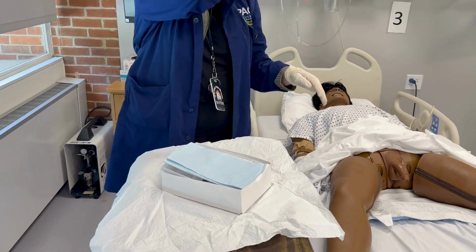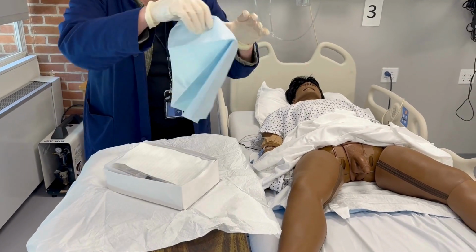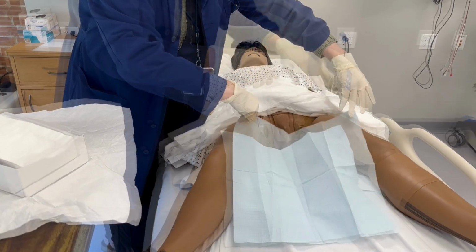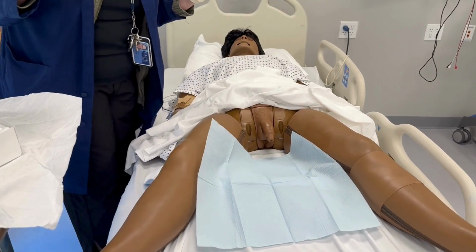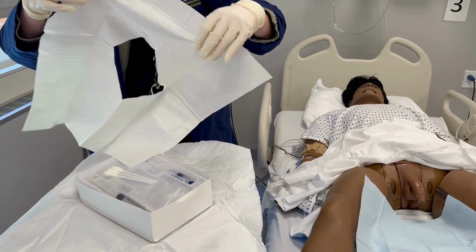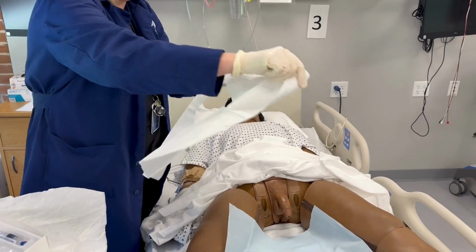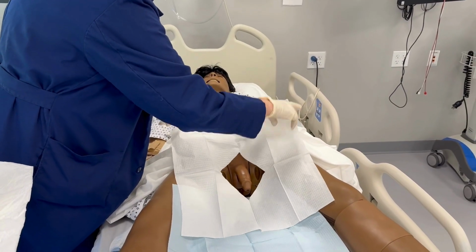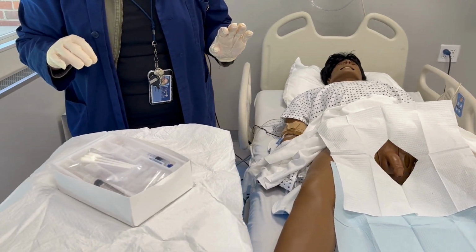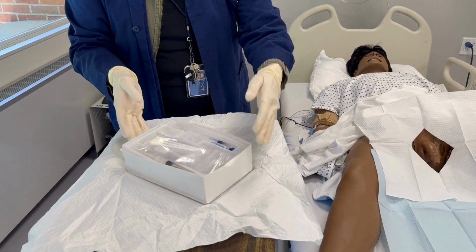Place sterile drape between the patient's thighs. Place a fenestrated sterile drape over the perineal area, exposing the penis. Move sterile tray from overbed table and place on the blue sterile drape between the patient's thighs.